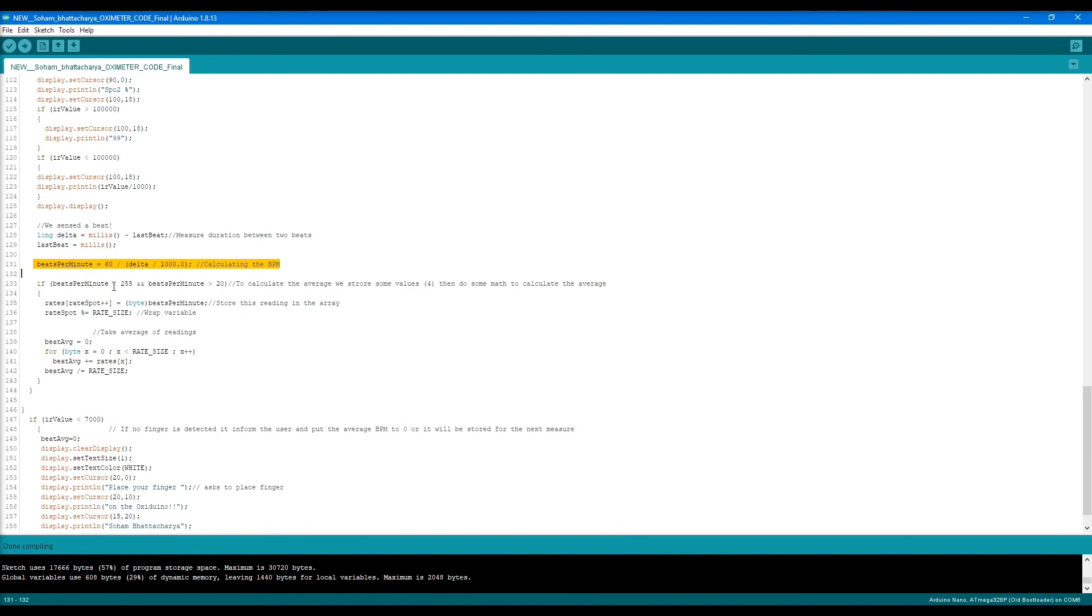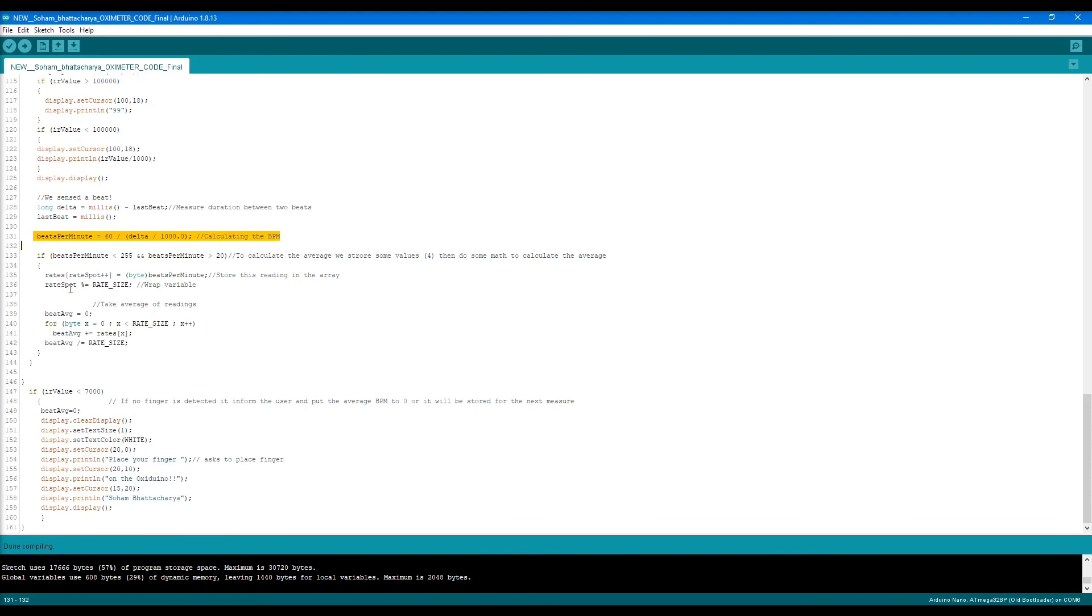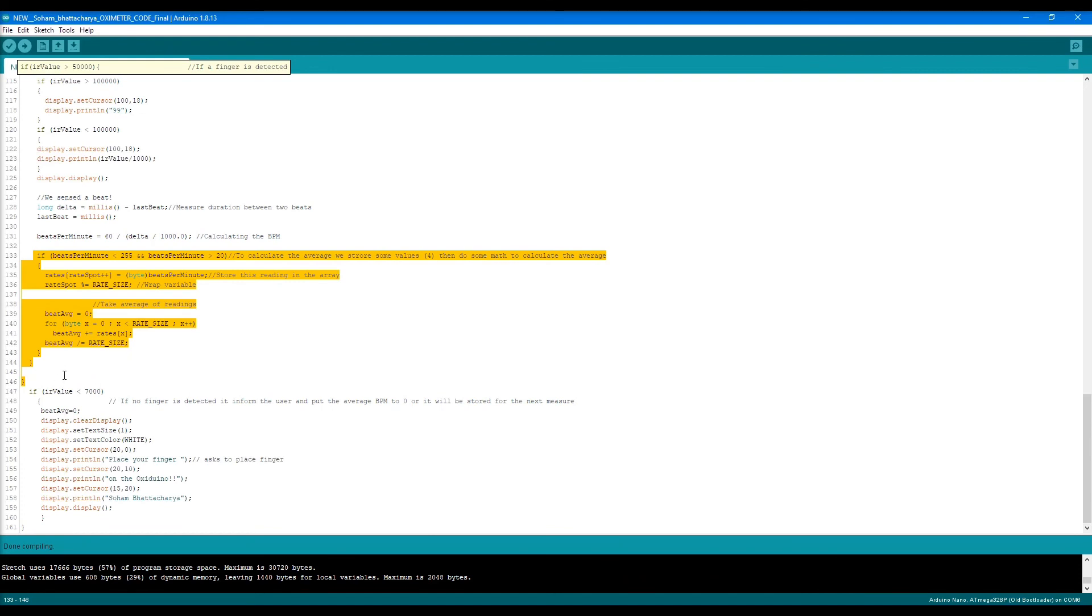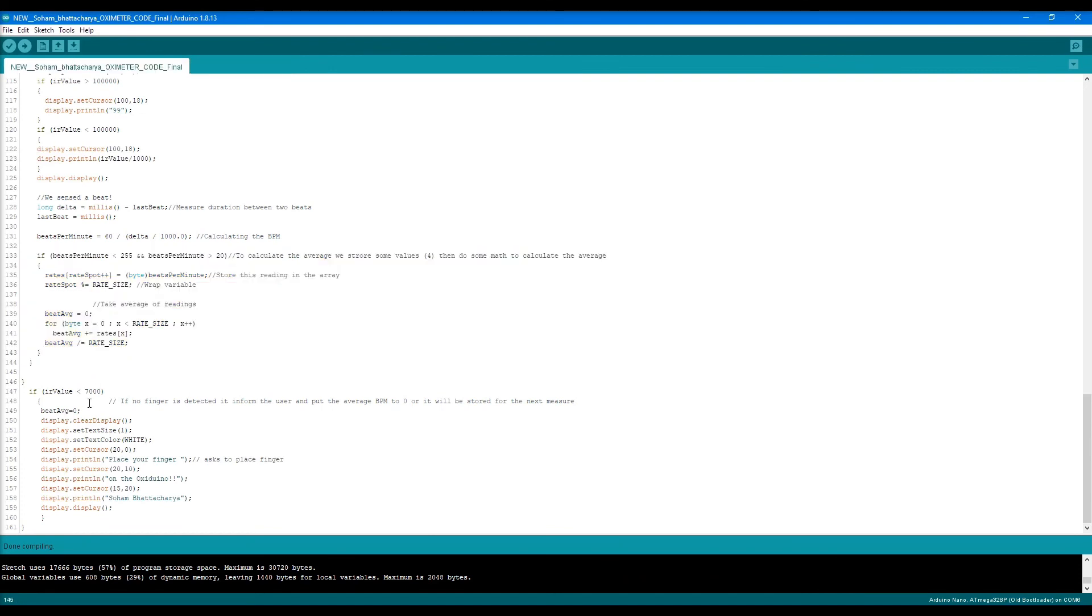We store some values in here, and a lot of math is done. The data collected and stored within the variables is averaged, and other calculations are done to print the last BPM value.